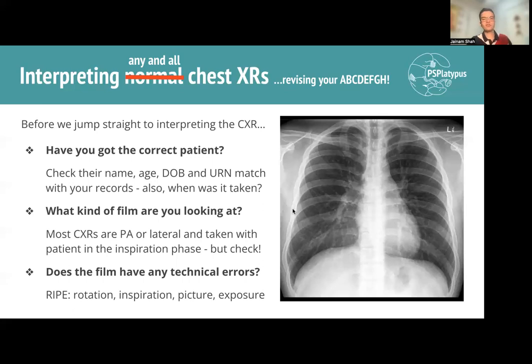Picture-wise, you're just having a look very, very generally at what the picture looks like. Is it grainy? Is it actually well-defined, etc.? Of course, having a look at the angles and the view and things like that.